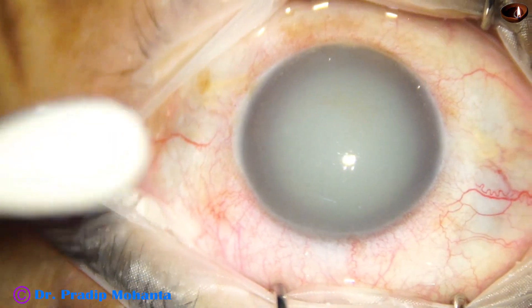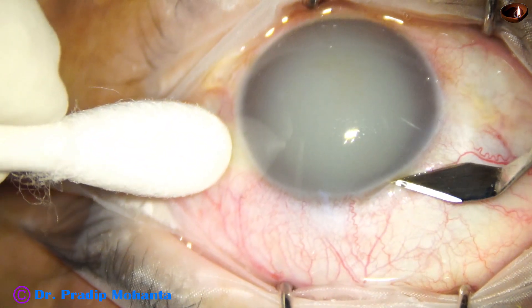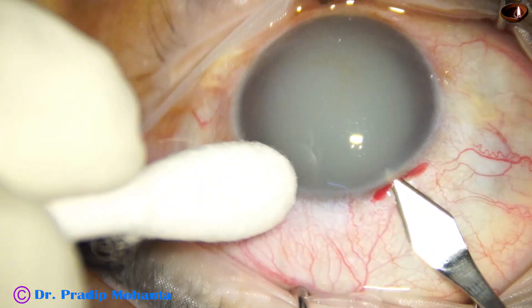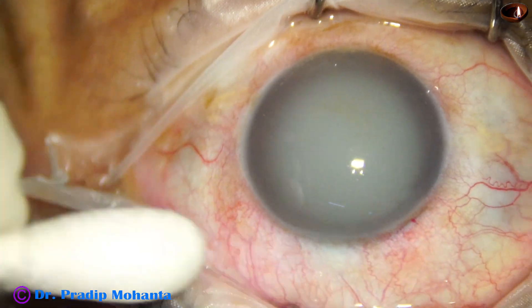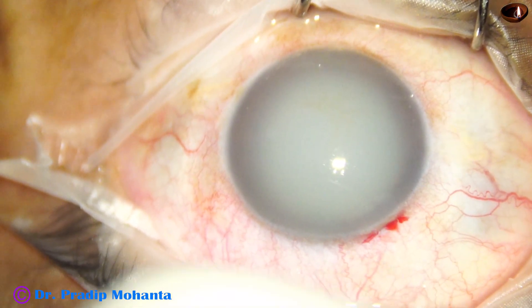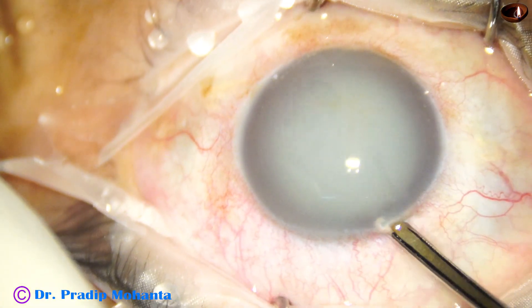We can see the aqueous humor has turned turbid. Iris details are not seen. Intraocular pressure was in the range of 60 mmHg, which has been reduced to about 30 mmHg with anti-glaucoma medications. This is a case of phacolytic glaucoma.